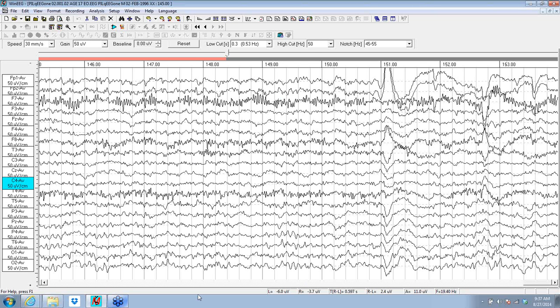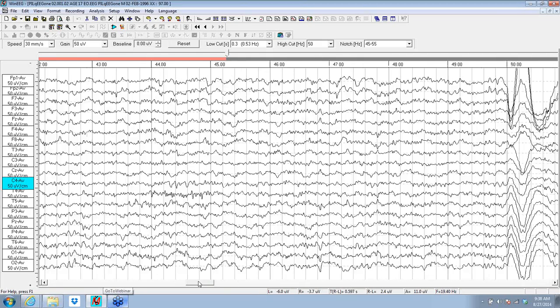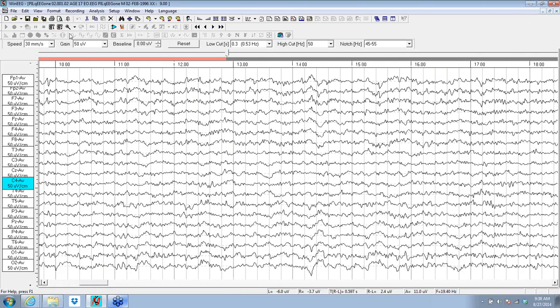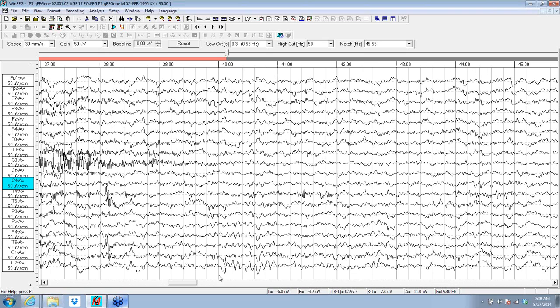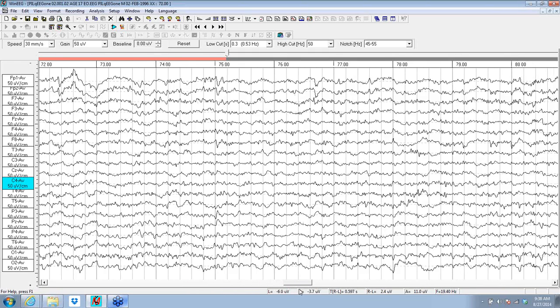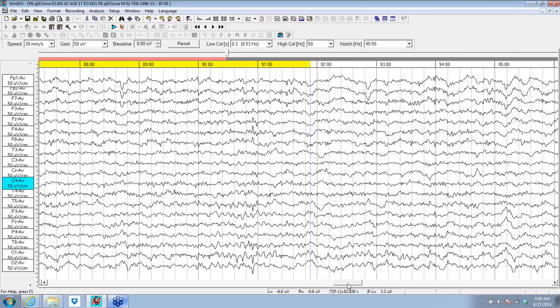Now, we got some eyes open alpha persistence in this case. And the EEG earlier was basically without much alpha. It was relatively lower voltage because this is not turned up or anything, and we've got a mixture of faster and slower content. But as we get into the EEG a little further, the alpha starts to happen, and the person basically is starting to lose a good grasp on being vigilant. So if we map the first portion of this before we really get into all that intense alpha, it'd only be up to about 90 seconds worth of it.